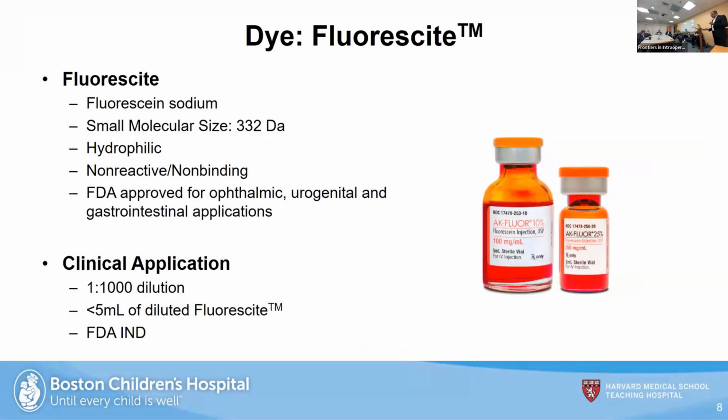Since we are using a confocal laser, we do need a dye. For this application, we are using an FDA-approved fluorescent dye called sodium fluorescein, commercially available as Fluorescite. It has a small molecular size, about 332 daltons. It's hydrophilic in nature. It's non-reactive and non-binding. It is, again, FDA-approved for ophthalmic, urogenital, and gastrointestinal applications.